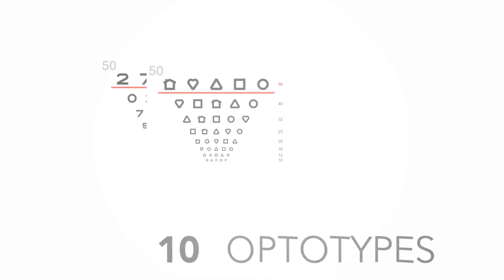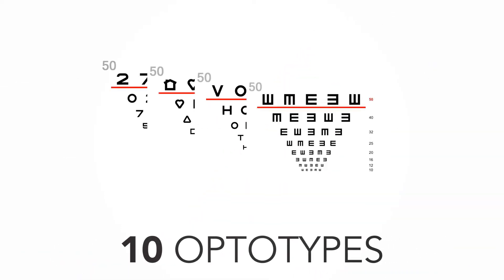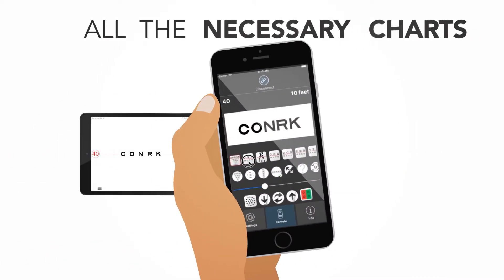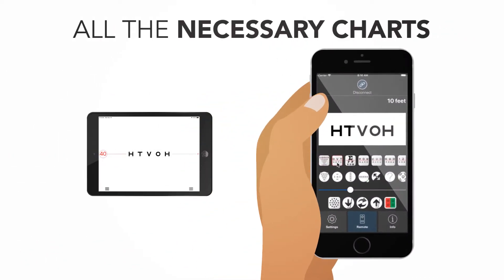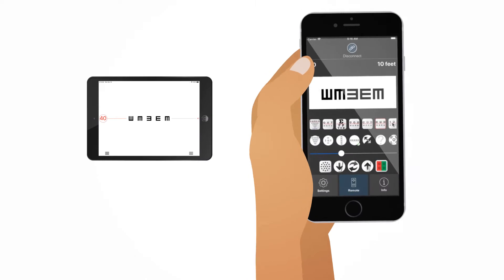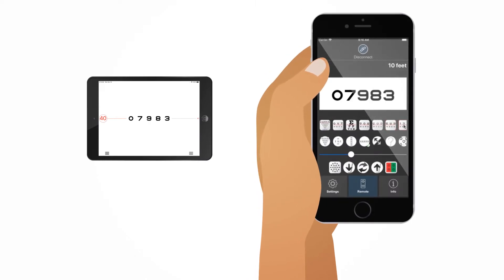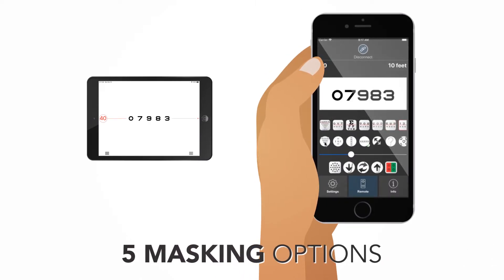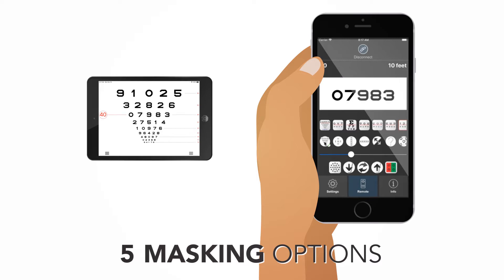The full range of optotypes provides you with the necessary charts for any type of patient. Use any one of the five masking options to isolate letters horizontally, vertically, singly, or to view the full chart.